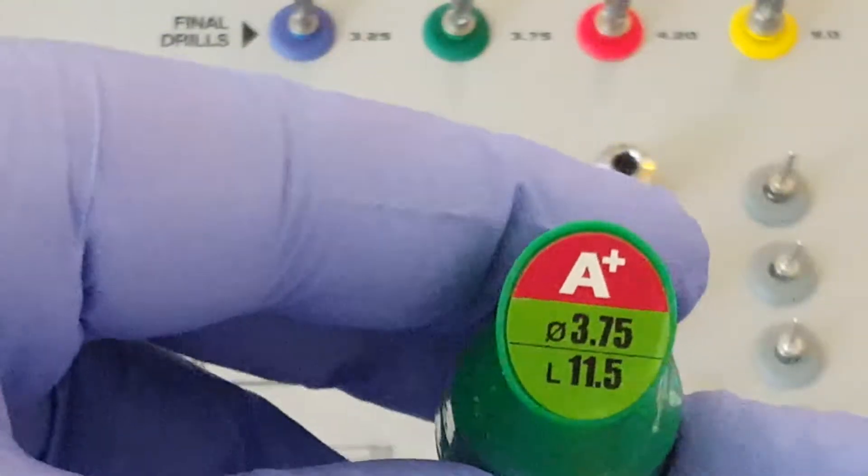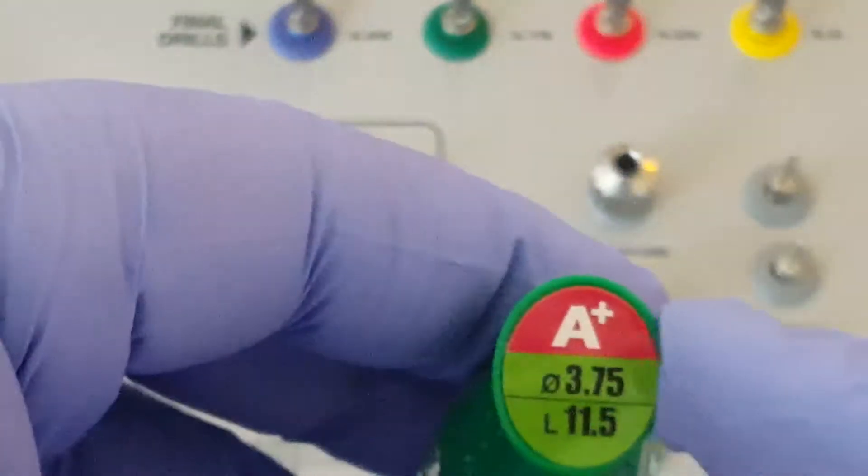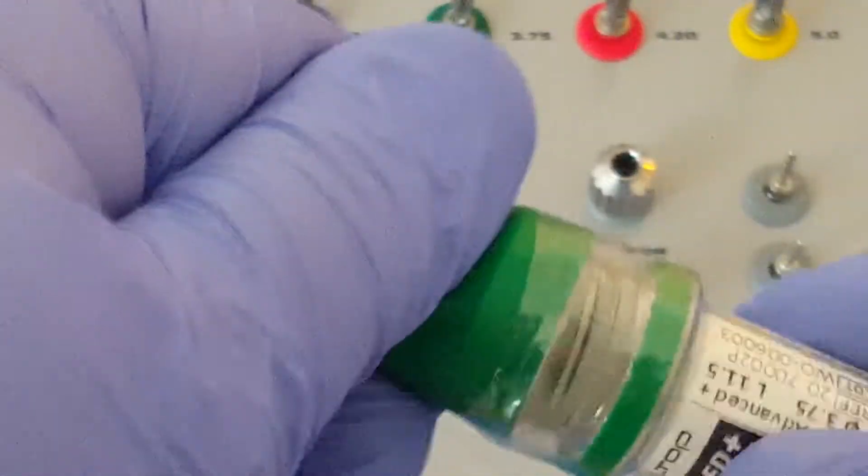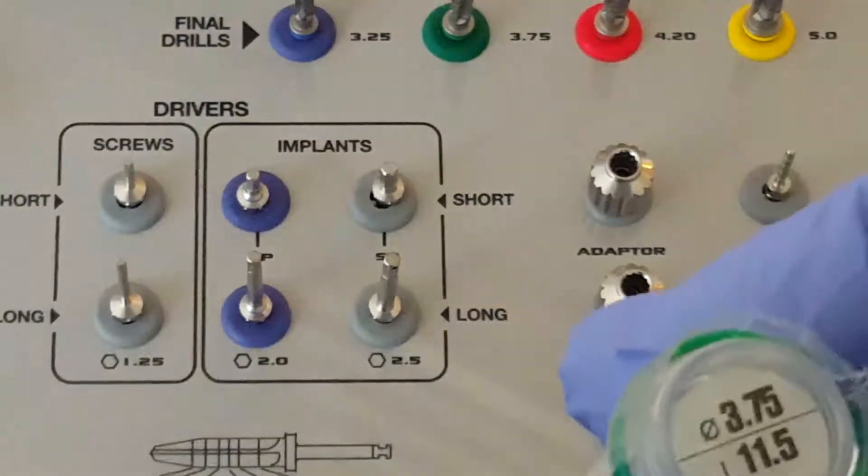If we look at a green vial, green again is 3.75, this is an advanced plus implant. We open the vial by twisting, again easily done by the doctor or the assistant.